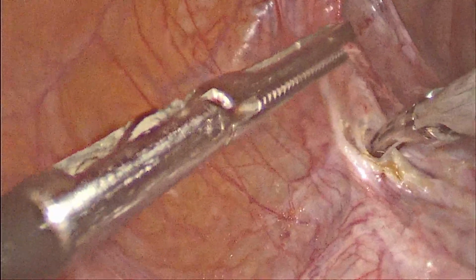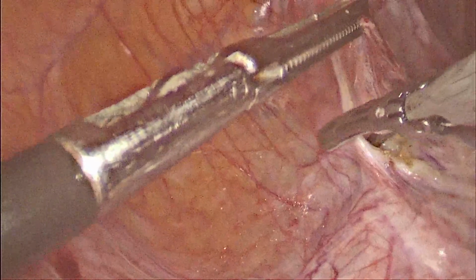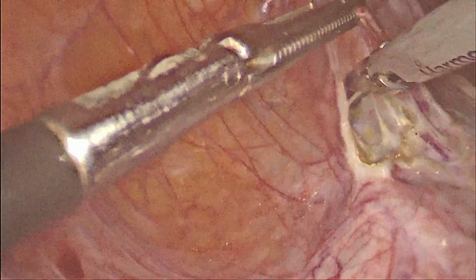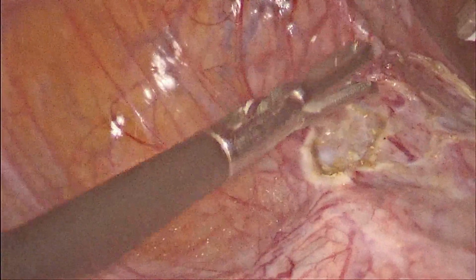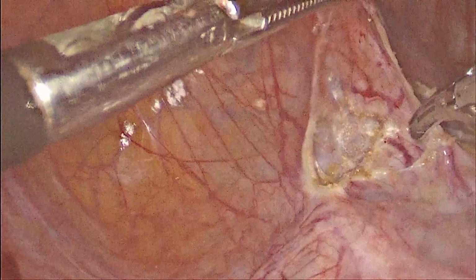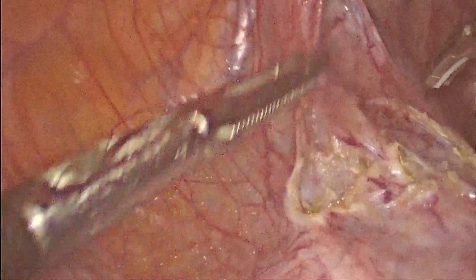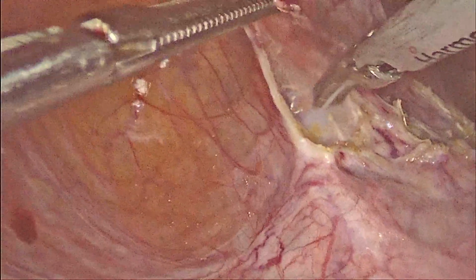So whenever we do the dissection, try to do fiber by fiber dissection. Identify the bladder and cervix separately, and do gentle dissection. The dissection should be sufficient to expose the scar site and expose the cervix enough to excise.